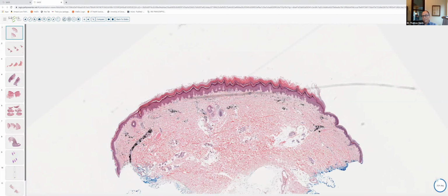We've got a fairly low concentration of follicular and sebaceous elements and a fairly thick dermis. The epidermis is kind of thinned with effacement of the rete ridge pattern, and we have this little depression in the epidermis. If we go down and take a look at the papillary dermis, we can again see effacement of the rete ridge pattern. We've got a few vertically oriented vessels here.